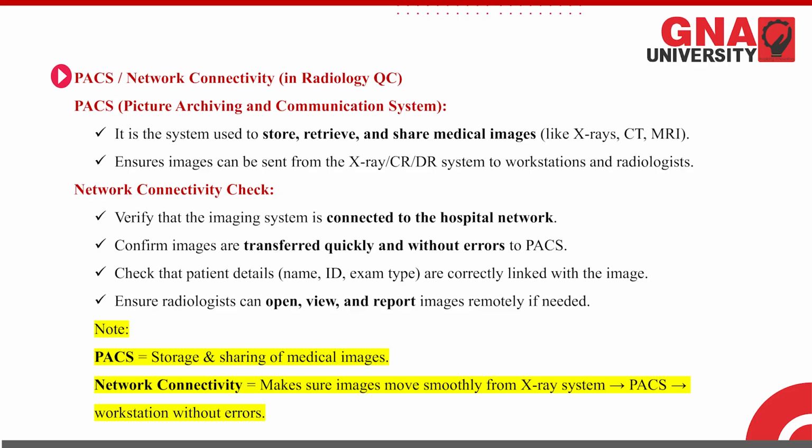And the next thing is to confirm that images are transferred from one system to another with the proper name, proper ID, and exam type correctly linked with the image.